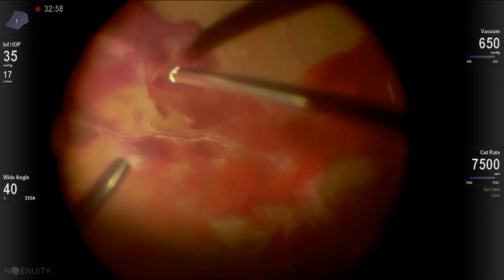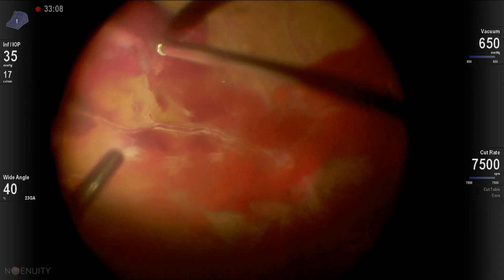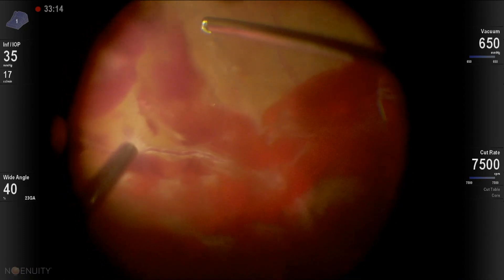How much you pull is just a judgment call. You have to be very careful when you're pulling on the retina in diabetic patients. The membranes are so adherent and the retina is thin and friable.